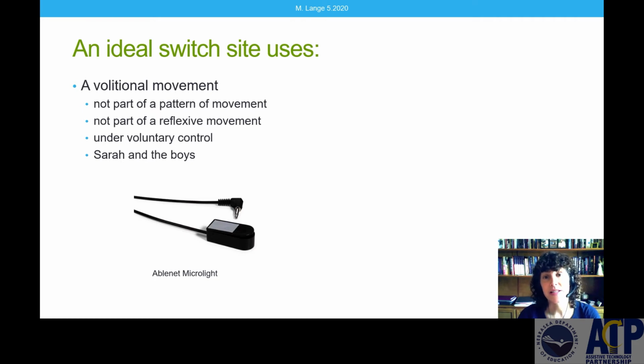What we did instead was to place those same switches behind her elbows. This allowed her to, with better control, volitional control, pull her arm back, retract it back into the switch to move forward. When she saw a cute boy, her tone would pull her arms forward, and she could stop and chat with him for a little bit. Took her longer to get to math class, but she stopped crashing into things.